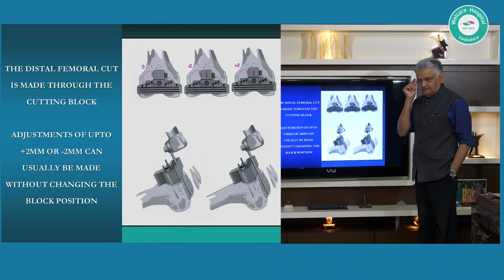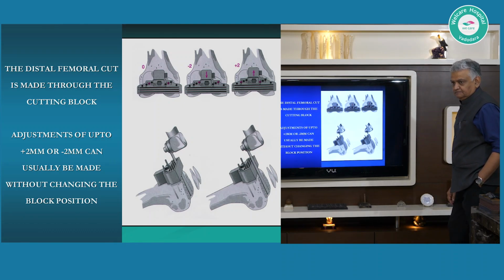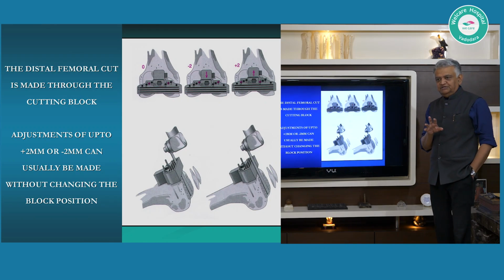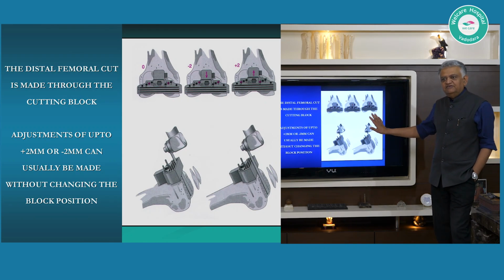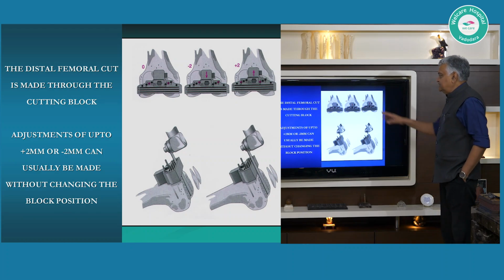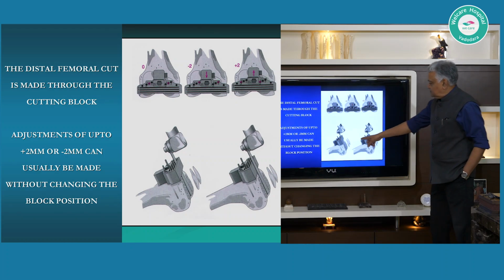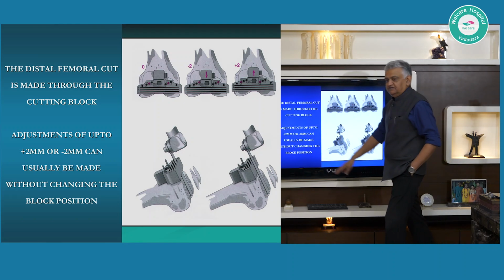Did you understand? Yeah, I wanted to ask, what are the situations when you would need to use the plus 2 minus 2? Very good, perfect question. Remember that this facility is available. When we discuss fixed flexion deformities and lax knees, that is when I will tell you when this will be very useful. So now, you have cut it, as it says you can adjust this here and there.